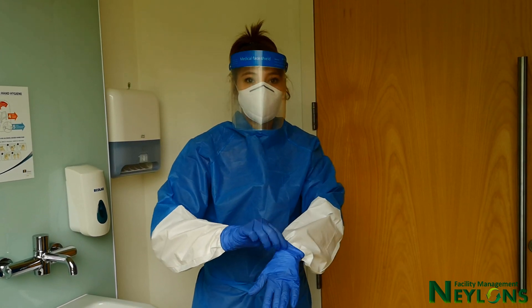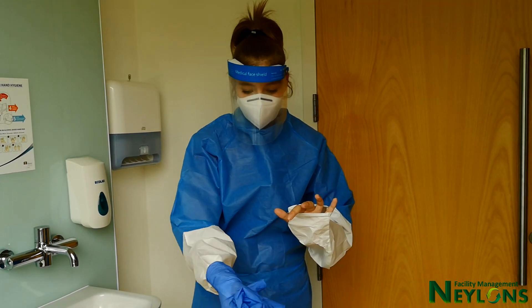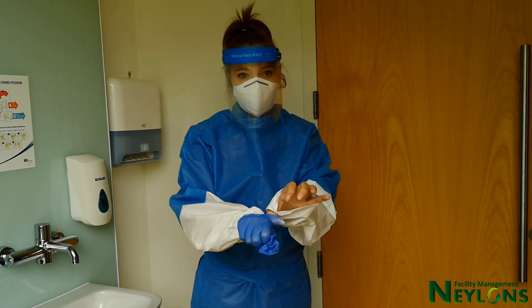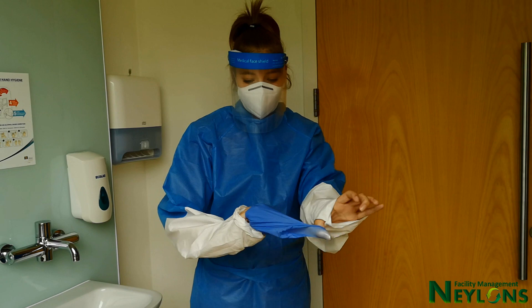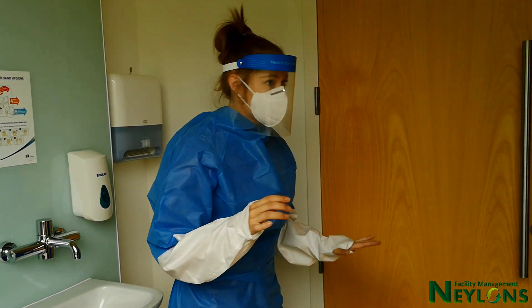When doffing PPE, these steps should be followed. Remove gloves by pinching the outside high at the back of the wrist and turning inside out. Place a finger on the inside of the other glove and pull over the contaminated glove from your other hand.